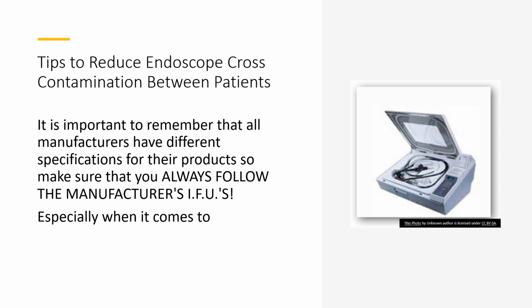This is especially true, again, when talking about brush sizes. You want to make sure that you're using the correct brush size, especially when you're working with the inside lumen of the endoscope, because if you have a brush size that is too small for the endoscope, then the brush will not be touching all of the sides of the lumen inside, and you're not going to be cleaning it. So always use a clean new brush, and the correct size, when cleaning any lumen, but especially an endoscope.